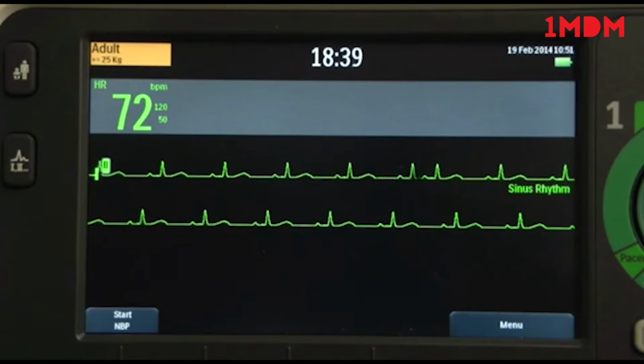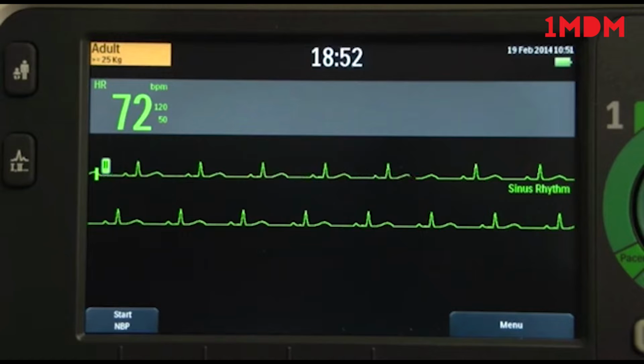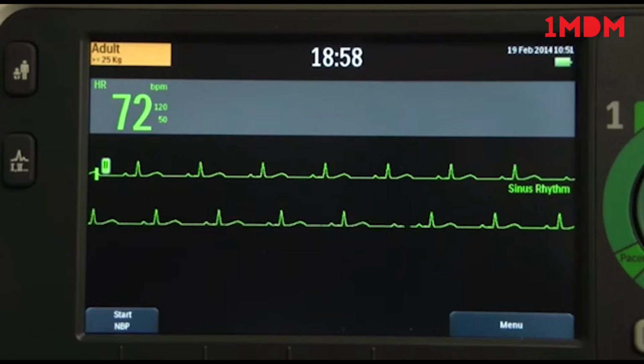When you turn on the DFM100 in Monitor, Manual Defibrillation, Synchronized Cardioversion mode, or switch into one of these modes from another mode, the default lead is displayed in wave sector 1. If that lead is not available or has poor ECG quality, the device automatically searches for the ECG lead with the best quality and displays that new lead in wave sector 1.